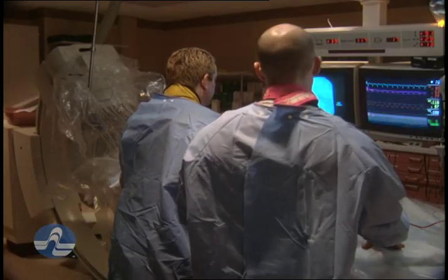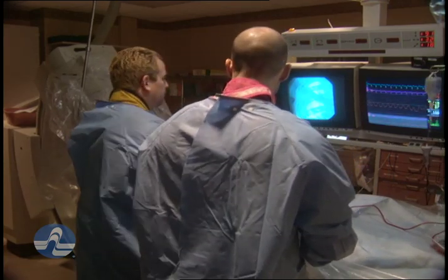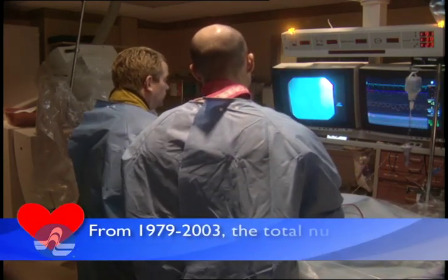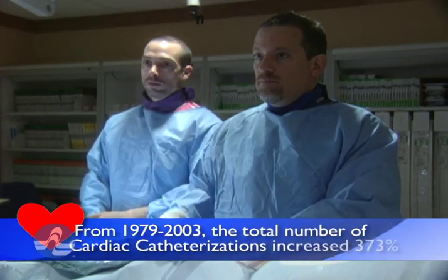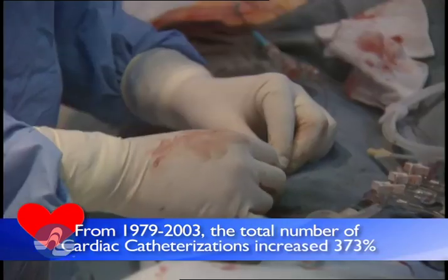We watch on x-ray as we bring the catheter up to the heart and then engage this catheter, which is just a hollow tube, right into the origin of the heart arteries.